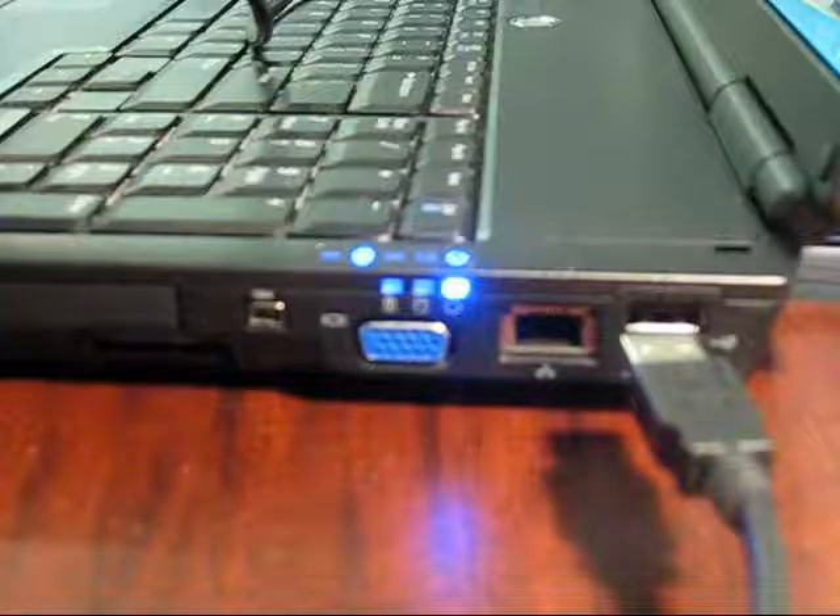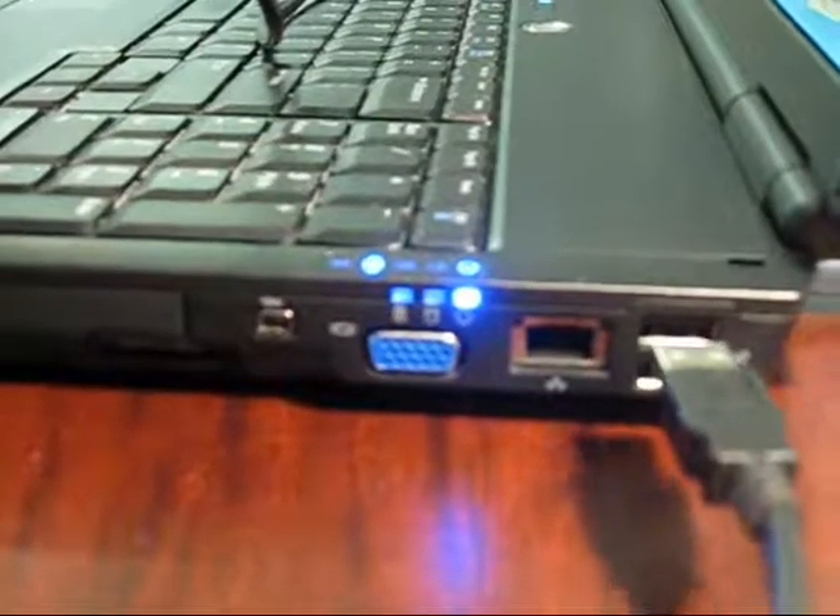Step 4. Plug ZoomX into the USB computer port, usually located at the front of a desktop computer or on the side of a laptop. You will hear two consecutive beeps indicating that the ZoomX is plugged in.